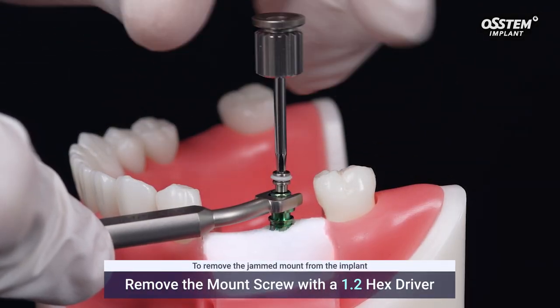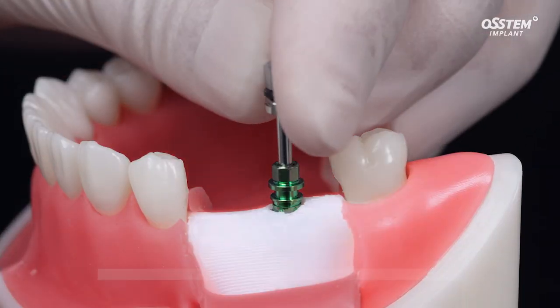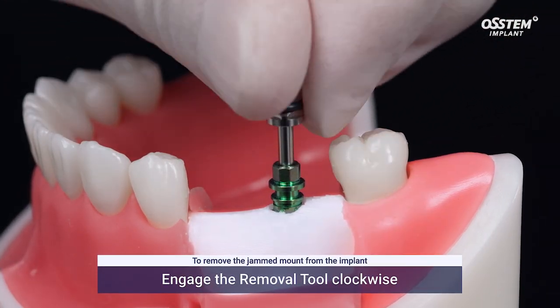First, remove the mount screw. Then, engage the removal tool clockwise.